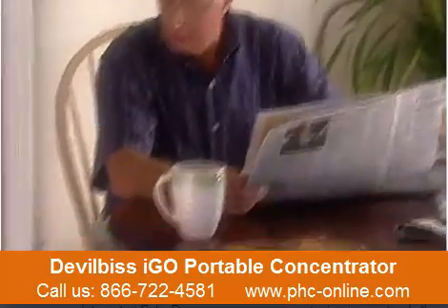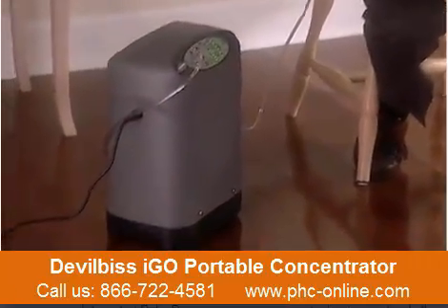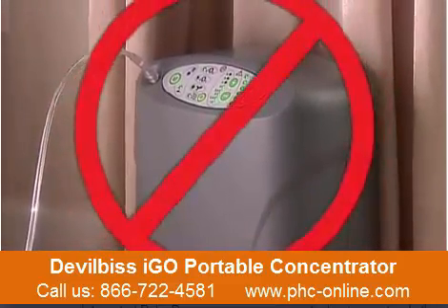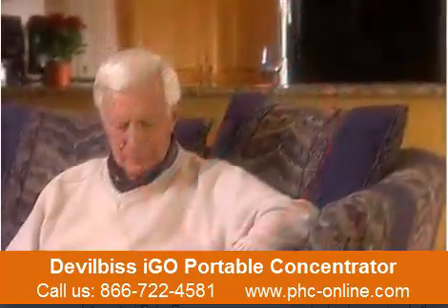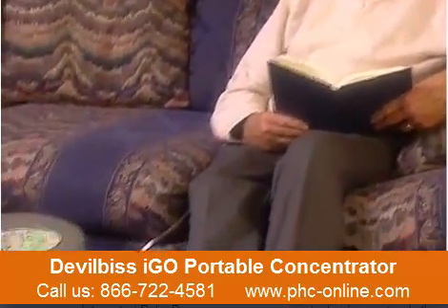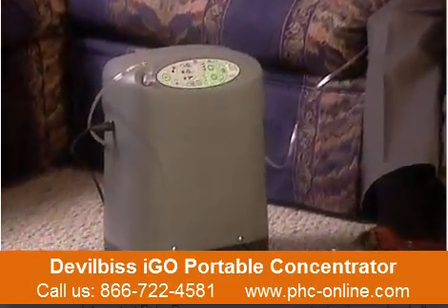Position your system so alerts can be heard, and never use the unit in a closet or any small enclosed space. Also make sure your iGo system is positioned at least 6 inches from walls, drapery, or any object that could prevent proper airflow. Place the unit in a well-ventilated location, free of pollutants and fumes, and be sure that the air inlet and exhaust are not blocked.